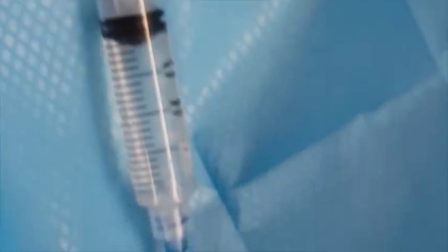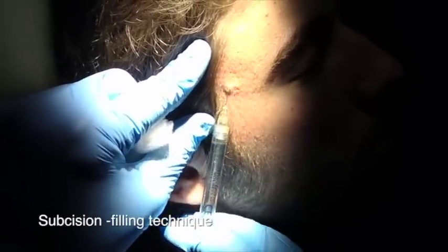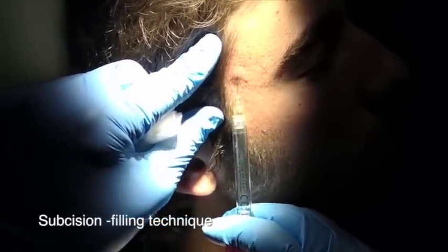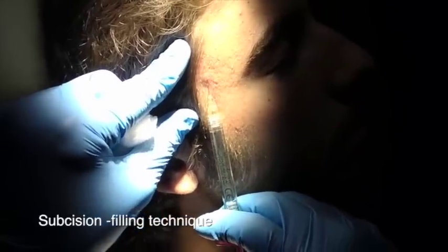This is just after two sessions and you can see I haven't injected anything there — that's not swelling, that's subcision itself. Microneedling works well, but logically I'm attacking the bonds from underneath at a horizontal angle compared to a vertical angle.